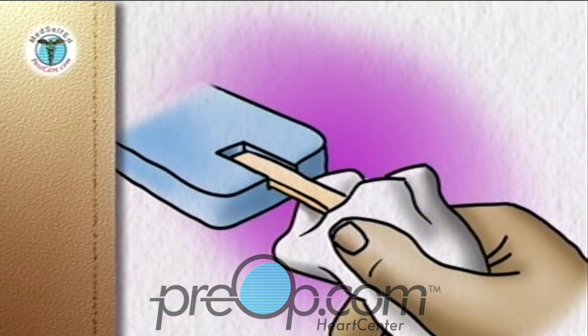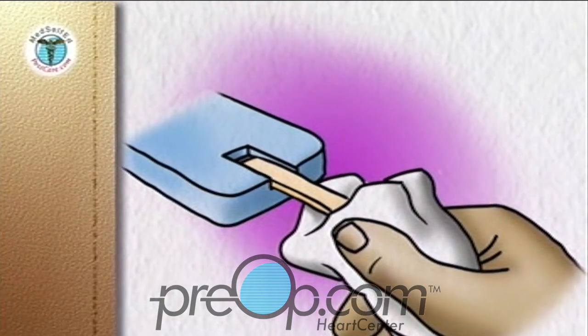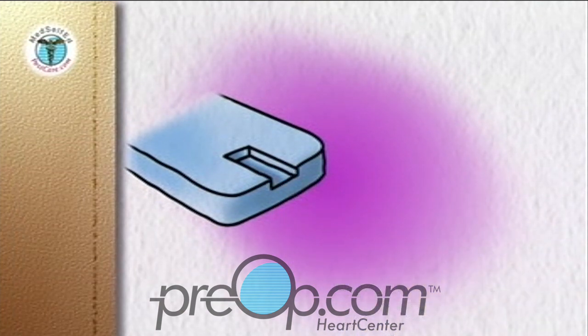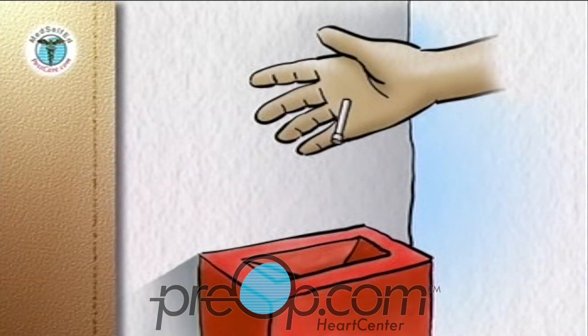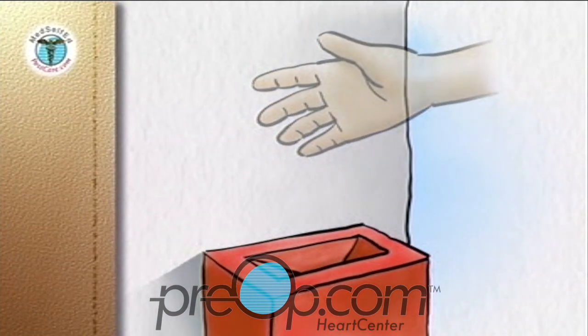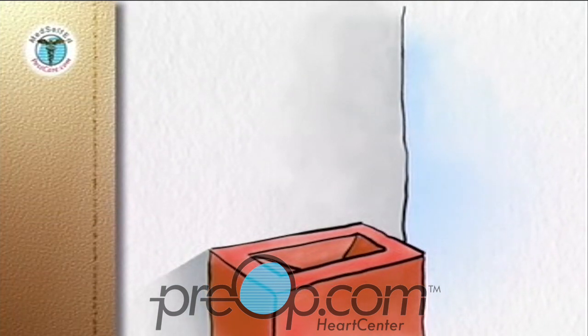Once the blood sugar reading on the meter is complete, use the tissue to grasp the test strip and pull it out of the meter. This usually turns the meter off. Discard the lancet in its protective cover and the used strip into a glass or puncture-proof container with a screw top, or a Sharps container purchased from your local pharmacy. Replace the cap on the container. When the container is full, cap it and discard it into the trash.